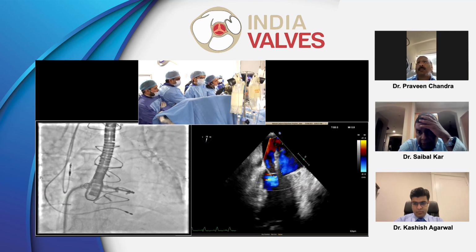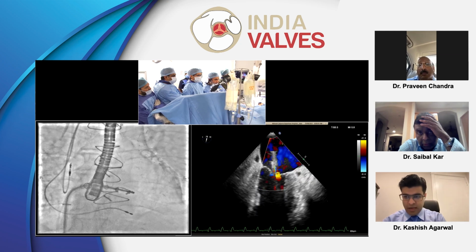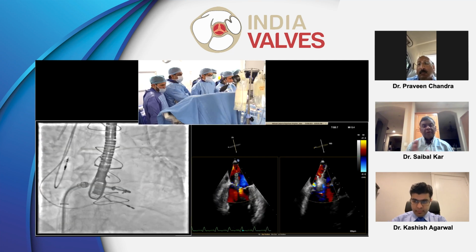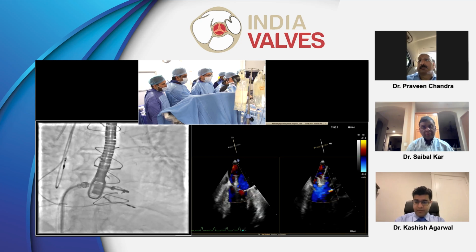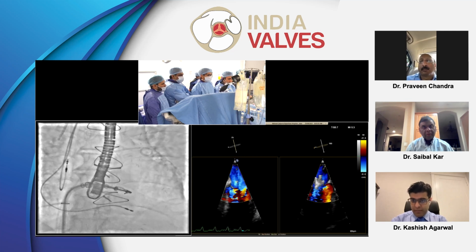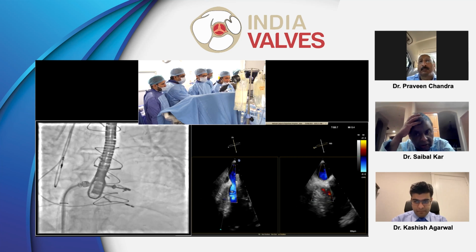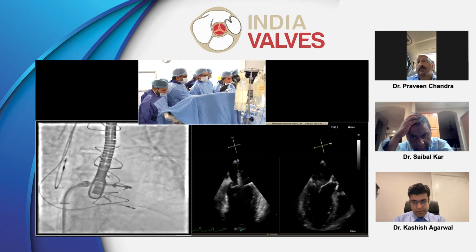What's the tidal volume? So Dr. Kar, why did you adjust the tidal volume for everyone? You decrease the tidal volume because the movement then decreases. If you increase the tidal volume, the clip and the valve keep moving. That's why sometimes you have to hold ventilation while going in, especially for a second clip. But holding ventilation will move you medial. So that's one of the things with tidal volume too: if you decrease the tidal volume, the overall excursion is less. So you see you've gone medial. Yeah. So I'm going to take a little M off. Yeah, holding ventilation and reducing tidal volume makes you go medial.